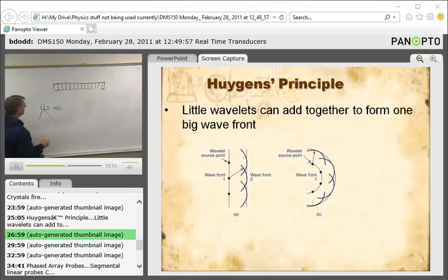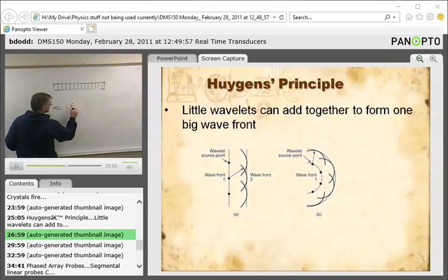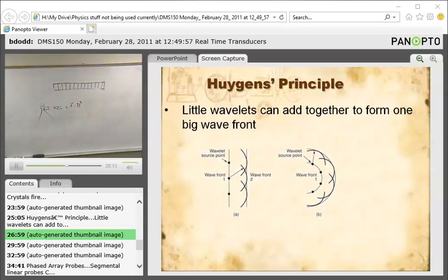Remember that? And it is related to the frequency times the diameter squared, and then that's over 6 if you want a fairly close estimate. But just remember the diameter squared.